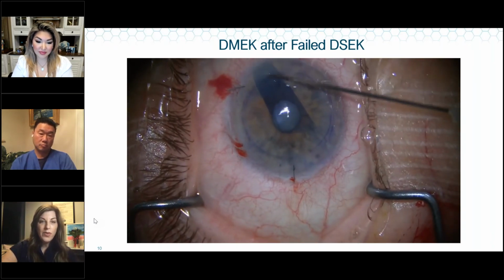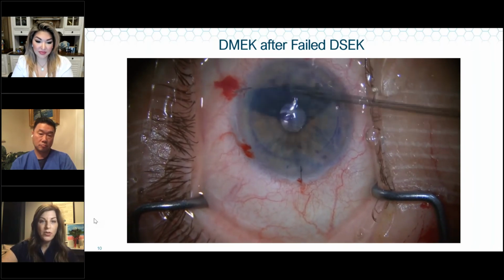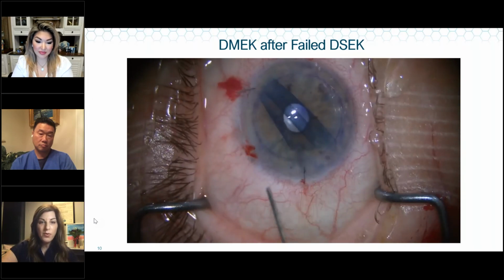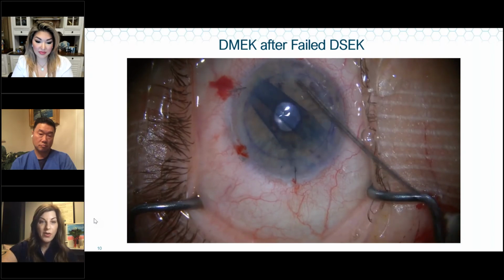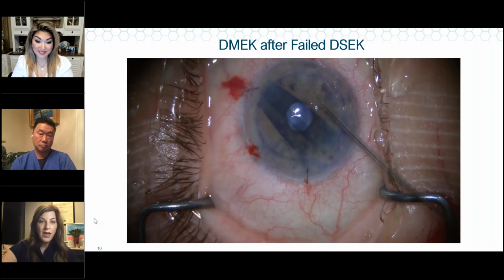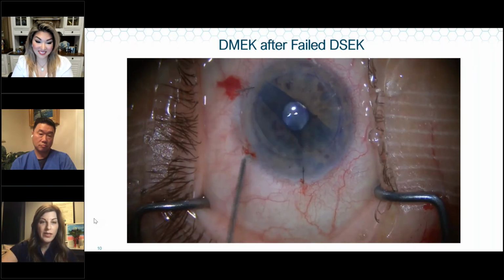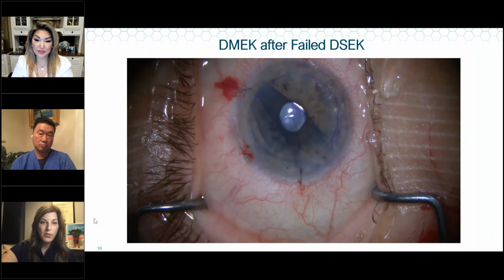And then I want to move it into the proper position before I try to unfold it. So you want to try and center that before you unfold it. Sometimes when you put the suture in first, that'll keep you from unfolding, but I see that S mark. I'm going to estimate how it's going to unfold, and then I'm going to do the Jerusalem technique where you pin it down and then unfold the carpet. So it's like a carpet roll technique.